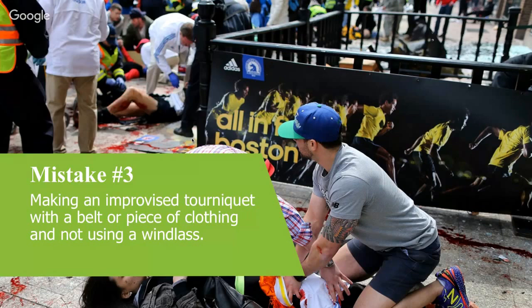you need to put a windlass of some form, whether it's trauma shears. Dan, when you did that blog, you used the wheel brace from your car as the windlass? Jack handle. Yep. Something rigid. There's actually a good study, and we'll punch it out in the email, looking at what works as a windlass, and there's things as diverse as chopsticks that will actually work. Yeah, but you'd have to happen to have a few chopsticks in your pocket.